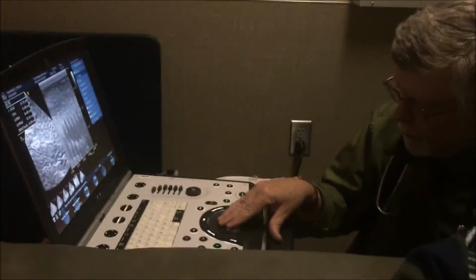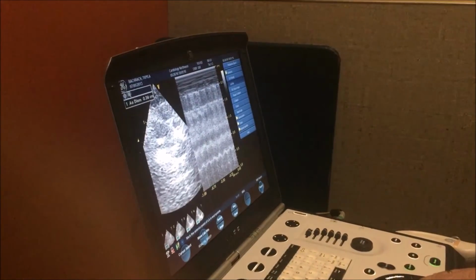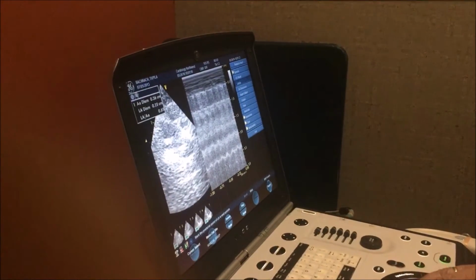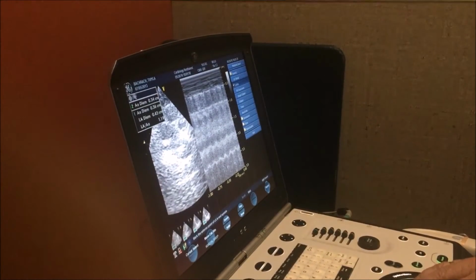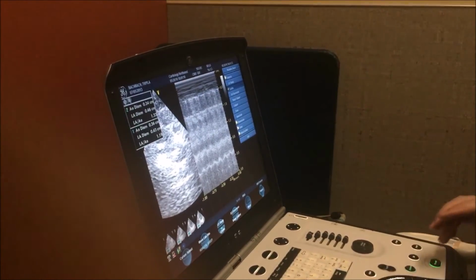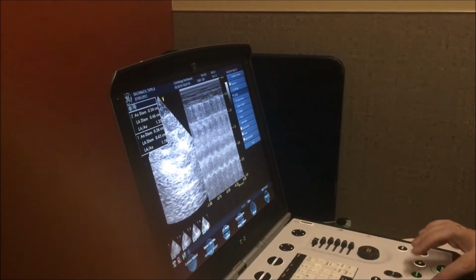This wall here moves really well, and so I think this is the aorta, and this is the left atrium. So primarily what I want to do is see a ratio of those two to each other, because that ratio is not that different from animal to animal. Okay, that's pretty good. And the ratio we're getting here is 1.3 and 1.2, and that's normal.